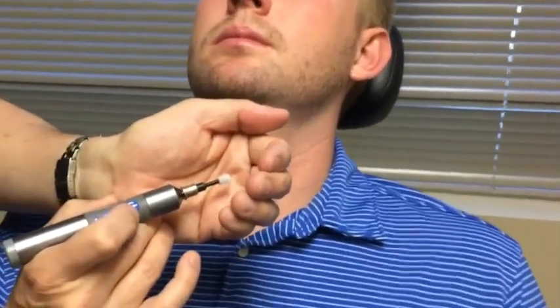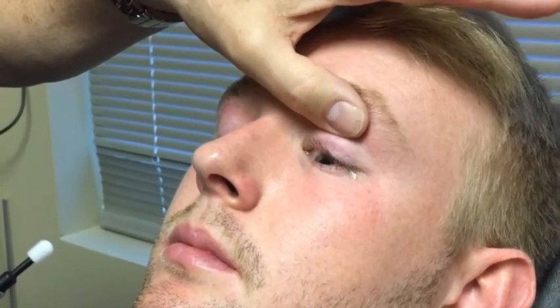looks down, come in again, flush with the thumb, rotate 90 degrees, and push in. The pushing in is the final critical step. You see, if I just rotate down, that's half the battle, but when I push in, watch that lid pop out. That's what you want right there. Okay, so again, we're going to hold this down 2 seconds. Patient looks down, come in just above the tarsal plate. It's about a 1/2 inch, 3/4 inches away from the lash line. Roll down and then push in. That pops the lid margin out.